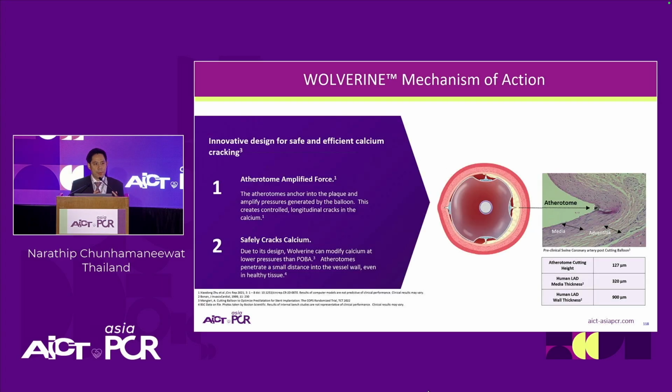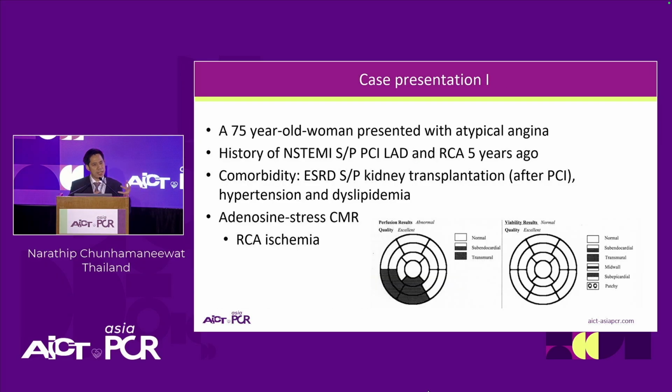Some people worry about perforation. It's not going to cause perforation because we know that the balloon height is shorter than the vessel wall. So if you do not oversize the cutting balloon, you will not have perforation, unless it is an eccentric plaque and you oversize the cutting balloon. So it is quite safe if you choose the size properly. But of course, there is no RCT about it. I'll show you from imaging how effective the cutting balloon is.